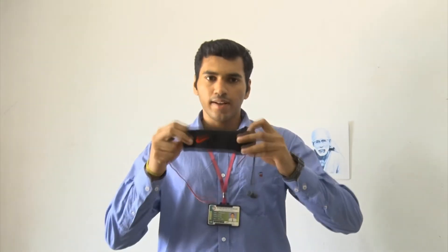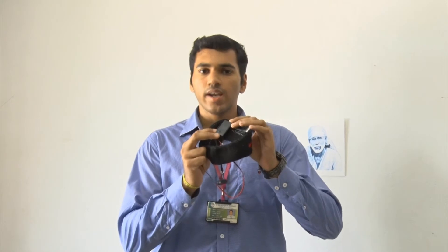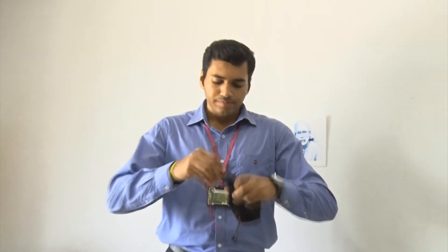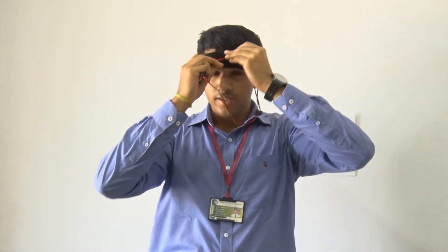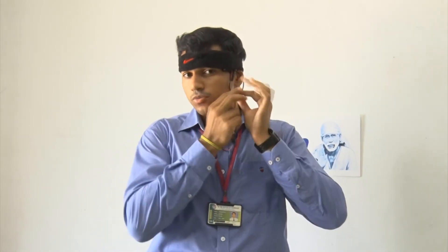Now we get into the technical details of the project. I have in my hand the headband that I'll be wearing over my head. This contains the brainwave sensor TGIN BMD-101 and a Bluetooth transmitter module. This is the power supply that contains our AA battery. I'm wearing it over my head like this — the sensor will be right near my forehead.